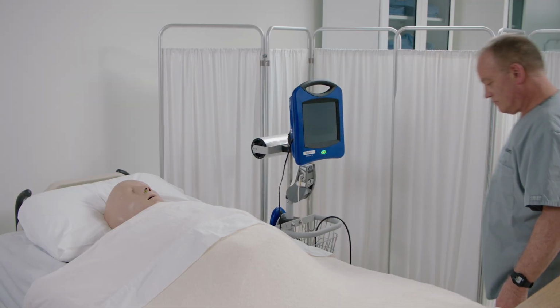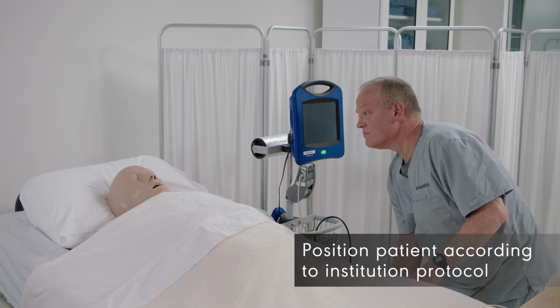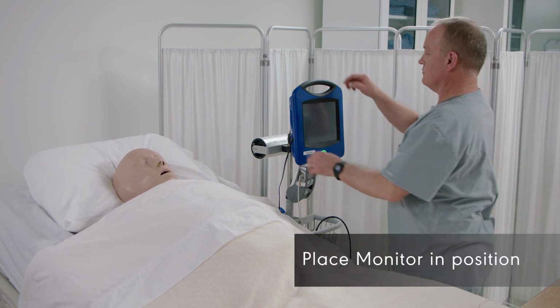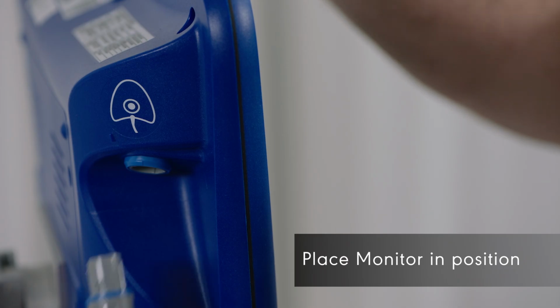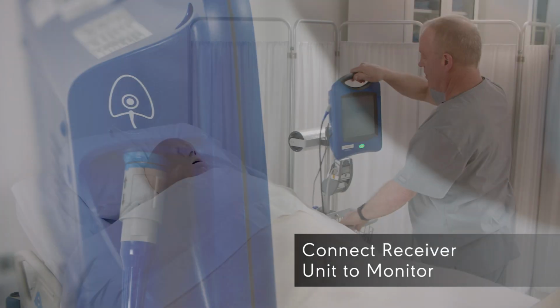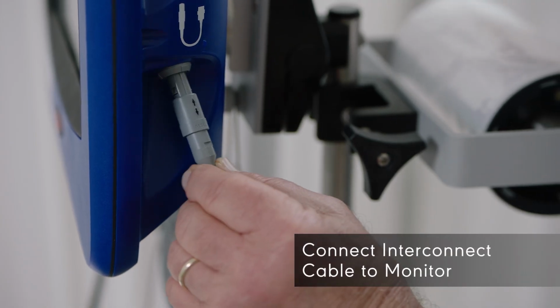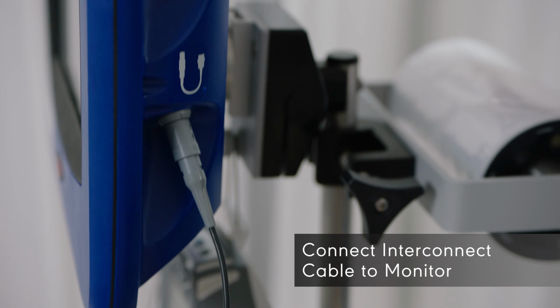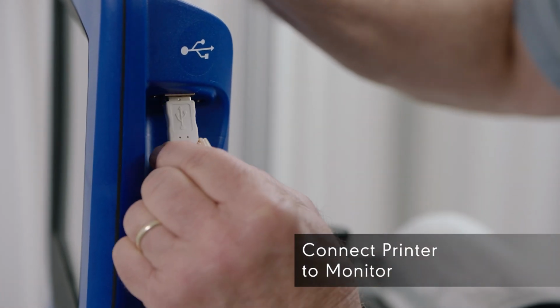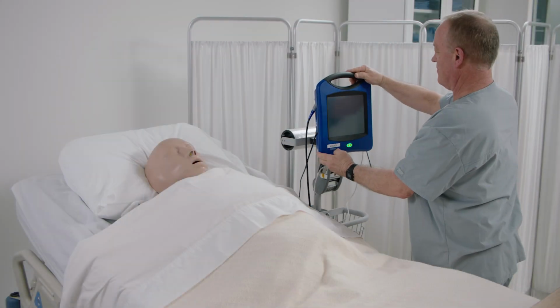Setup. Position the patient according to your institution protocol. Place the monitor in position. Connect the receiver unit to the monitor. Connect the interconnect cable to the monitor. Optional: connect the printer to the monitor.